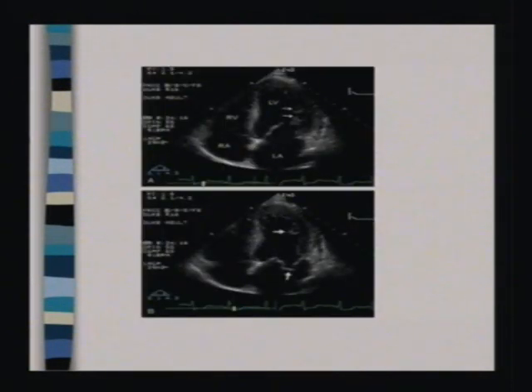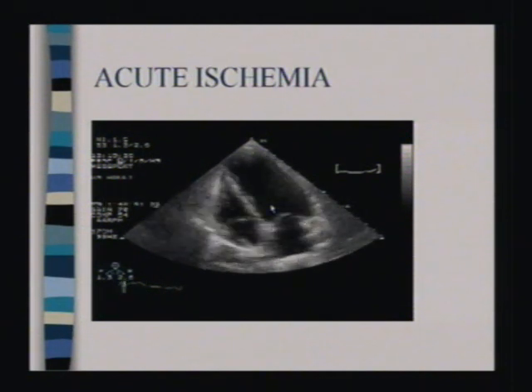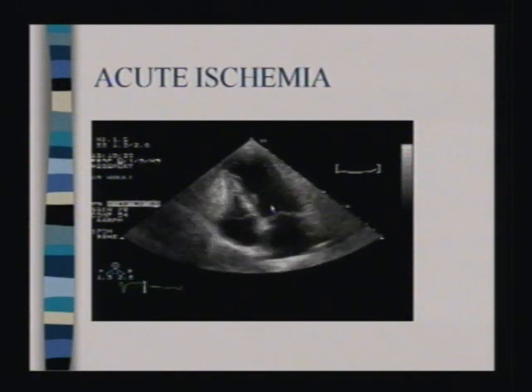Here is a case of a patient who comes to you suddenly with some MR, and he was in a very bad state. You do an echo and you see there is a ruptured chorda. This is a patient who came with severe chest pain. ECG changes, echo done, shows you LAD area hypokinesis in this patient.